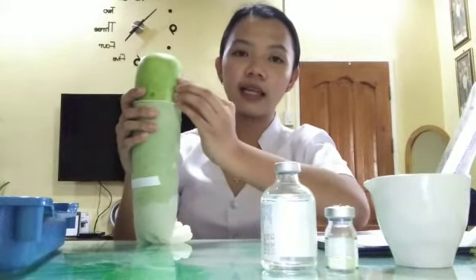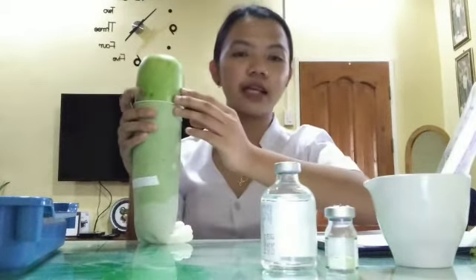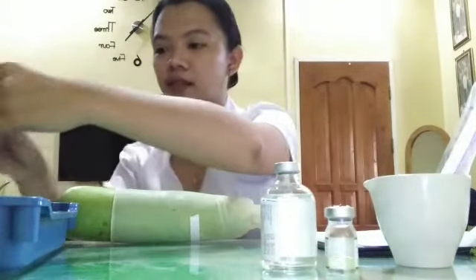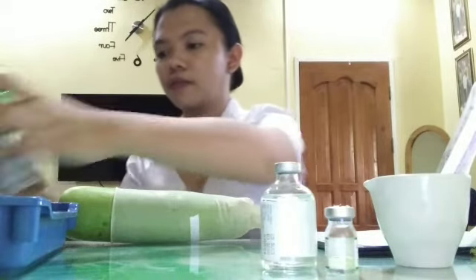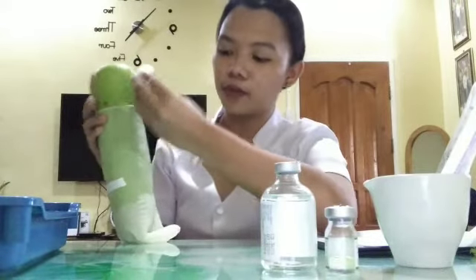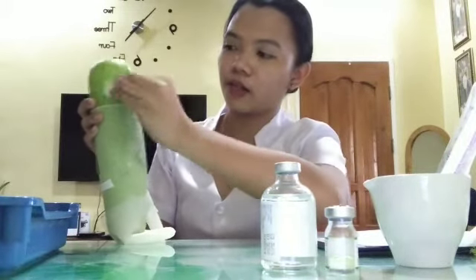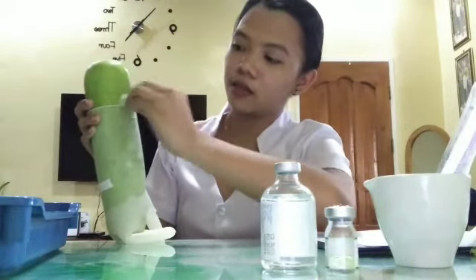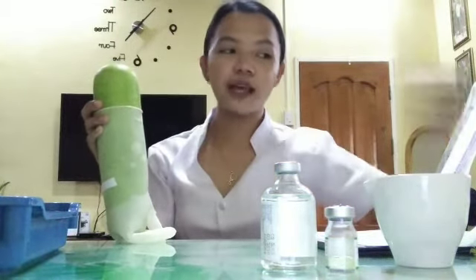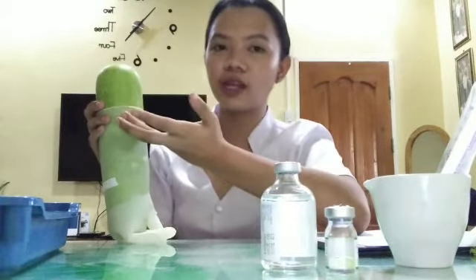This is the site that we will be injecting, which is the upper arm of the patient, and then we will first clean it. Again, by cleaning it, we will be starting from the center and then outward. And then we will let it dry. Assuming that it is already dry.